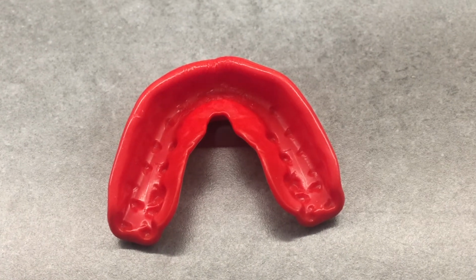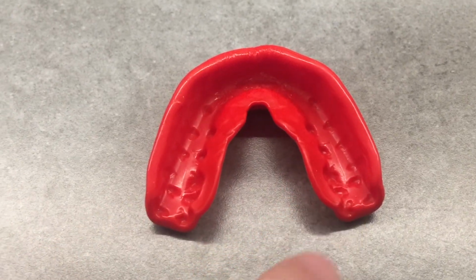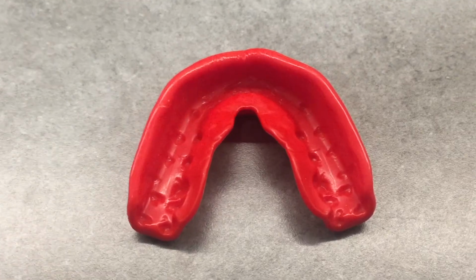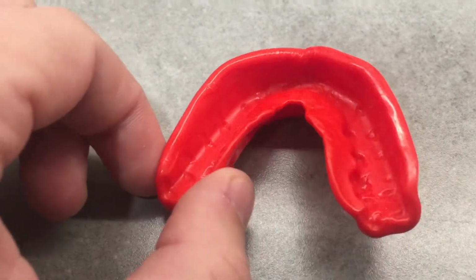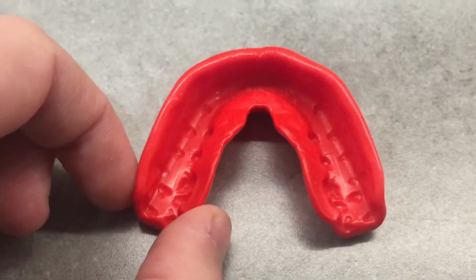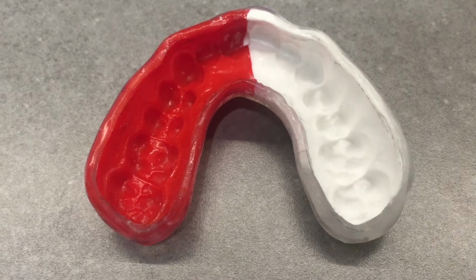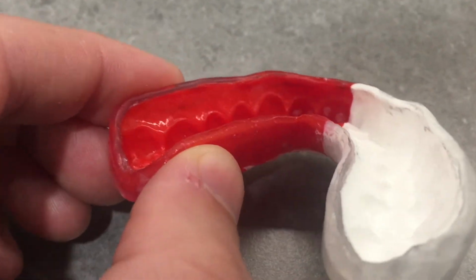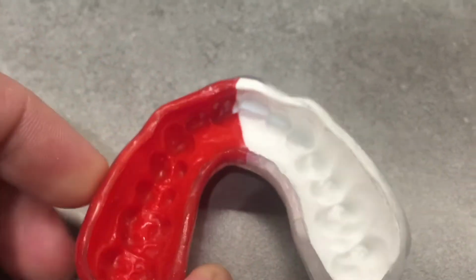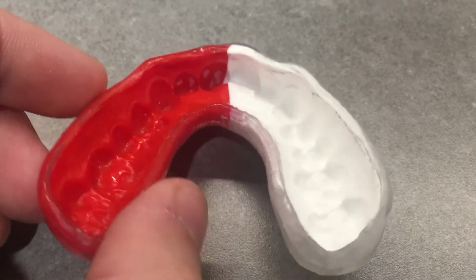Looking at the occlusal surface of my boil and bite mouthguard, you can see that my molars have made some indentations here, but it isn't a very good capture of the entire tooth. And because the mouthguard wasn't form-fitted around the tooth, you can't see where the tooth starts or ends, and this is the reason why the suction and retention is quite poor. Compare that to my custom mouthguard, where you can see the entire occlusal pattern, all the way from the top of the tooth down to where the tooth ends and the gum starts. This is what gives this mouthguard such excellent retention and such excellent suction.